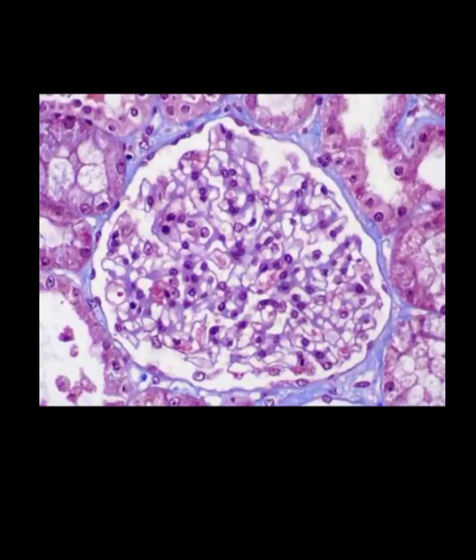So this is a normal glomerulus. The capillary lumens are patent, and there are no endocapillary or extracapillary deposits. This is the normal glomeruli. So there are several differential diagnoses of normal glomerulus.